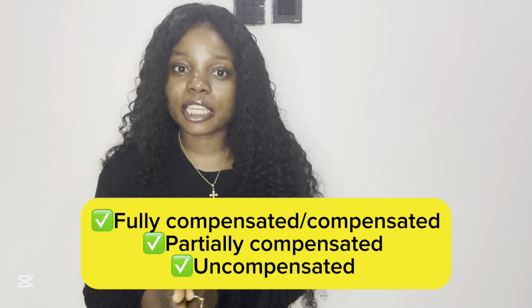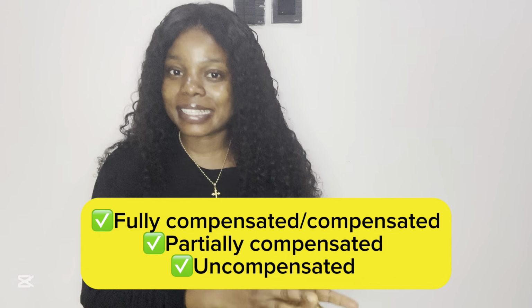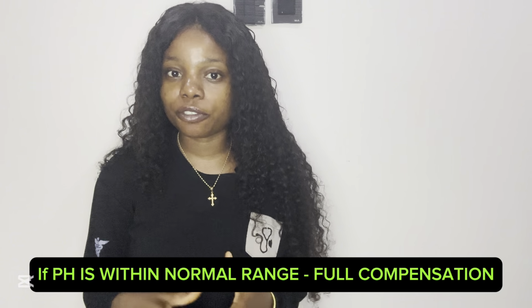You have to check if it is uncompensated, or you have to check if it is partially compensated. So in checking if it is fully compensated, the imbalance can be said to be fully compensated if the pH has been brought to the normal value, that normal value of 7.35 to 7.45.